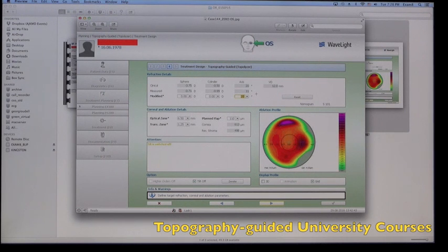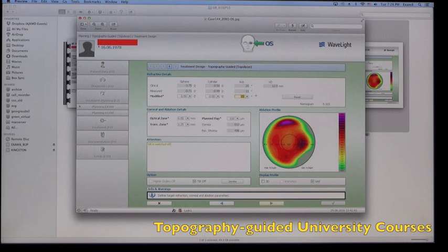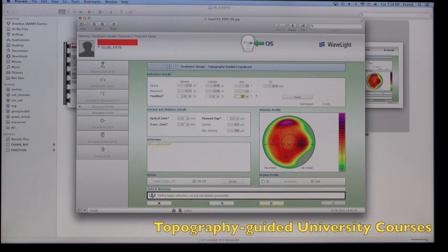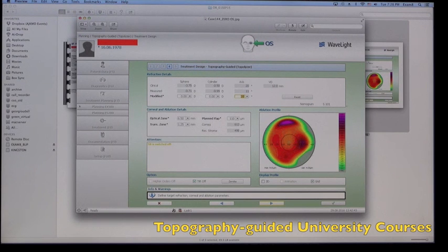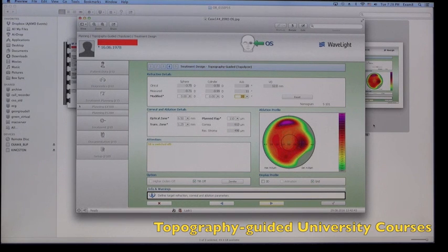And in a lot of cases, you'll notice that the amount and axis of cylinder is different from the clinical refraction. Also, other things to pay attention here is whether there's angle kappa, and angle kappa is easily recognized here if we correlate the normalization.